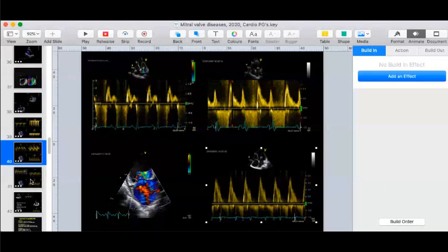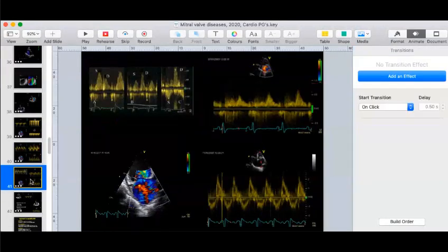So we are still with how to assess severity of MR. Now, what is this here? What sampling has been done? Pulmonary venous waves. So how can you use pulmonary waves to assess severity of MR? Systolic reversal. Flow reversal. Right.